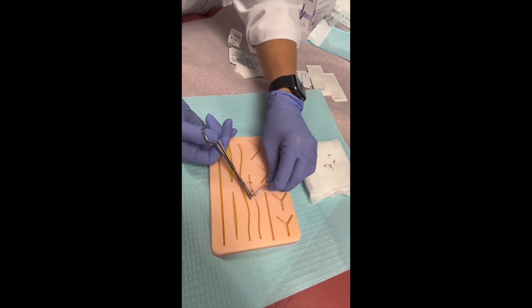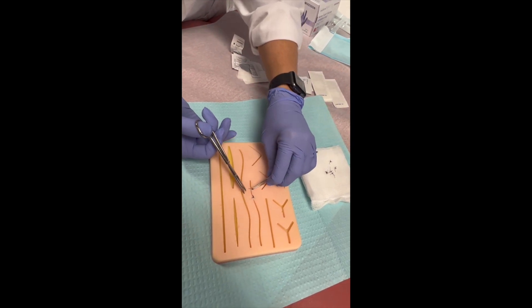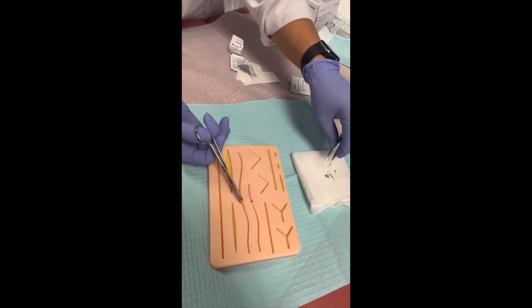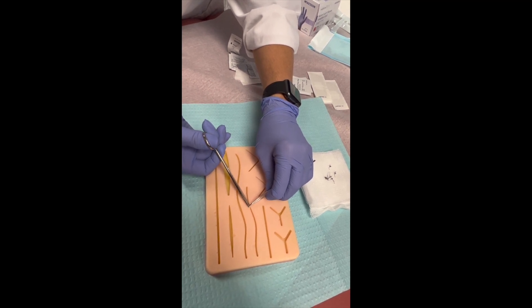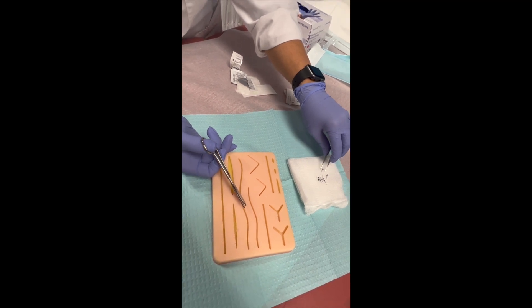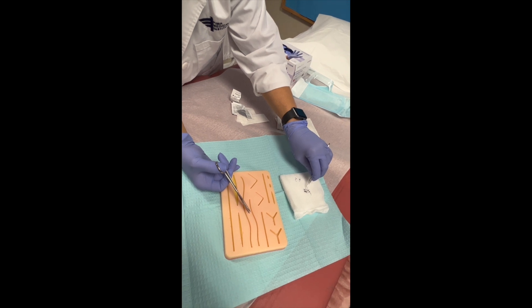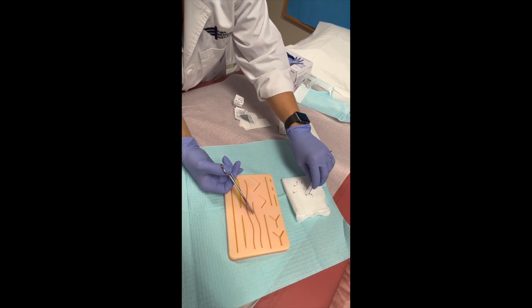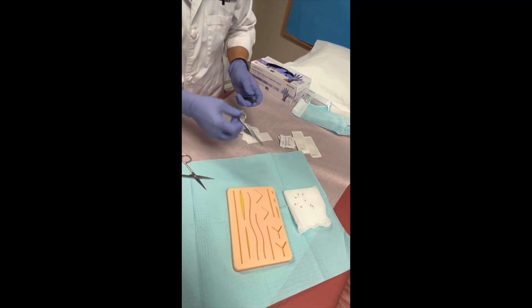As a medical assistant, we are not allowed to remove sutures or staples until the provider confirms it. We make sure the provider sees the patient first, then we can go ahead and take them out after asking the appropriate questions. Now I've got eight of them out and I'm going to count them again, making sure I have all of them.